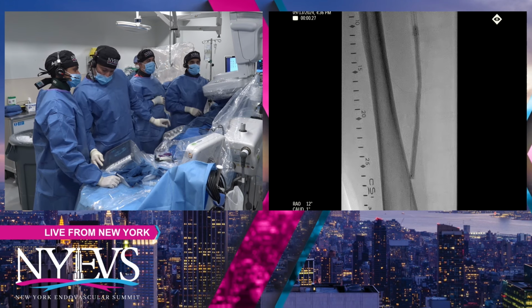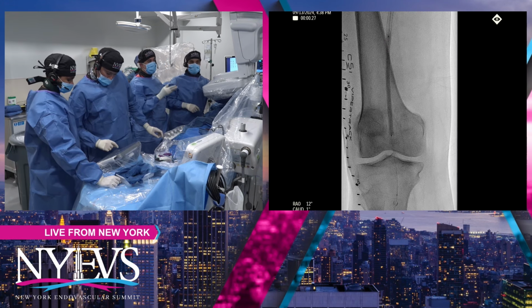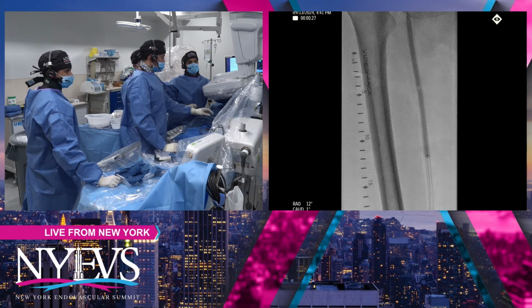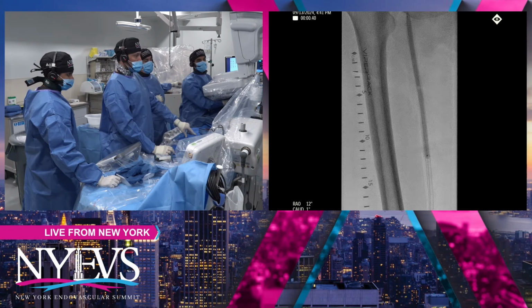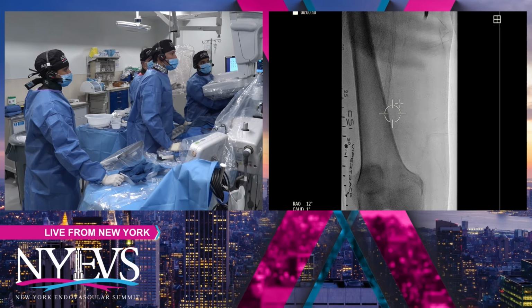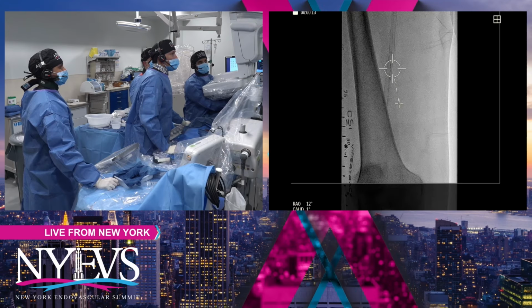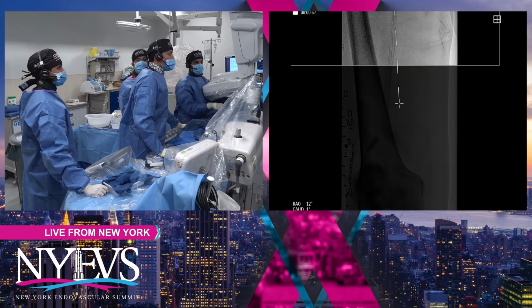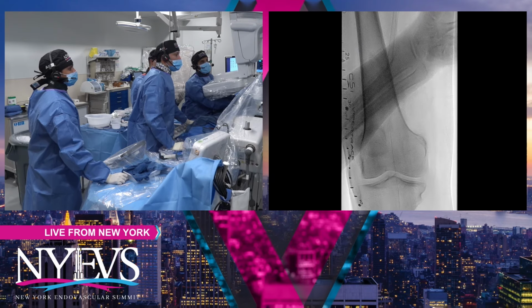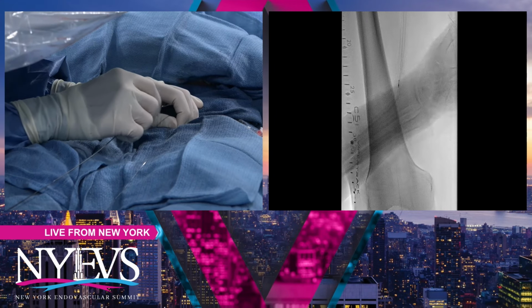So we did our long 6-0 DCBs in the stent as we wanted to, and 5-0 distally, to see if we can avoid putting a stent distally. Because we are proximally anyway for the ostium, we were thinking of doing a stent as well. Before we finish our DCB, we're going to run a quick IVUS, then show you an angiogram of how it looks, and then decide on the definitive therapy.